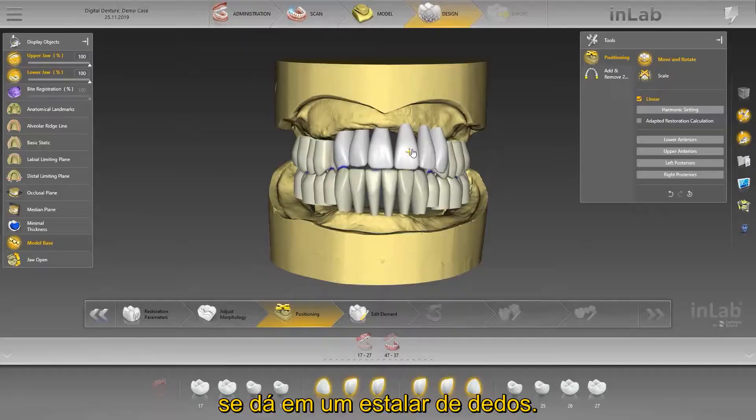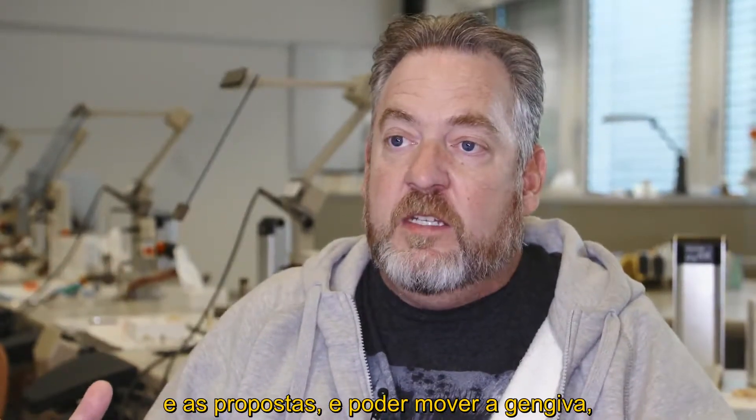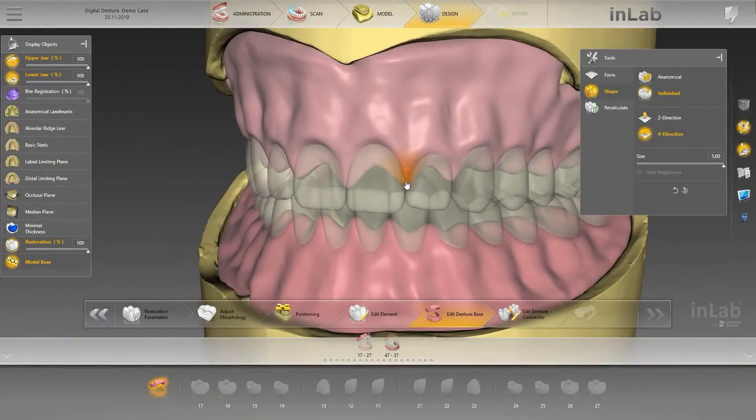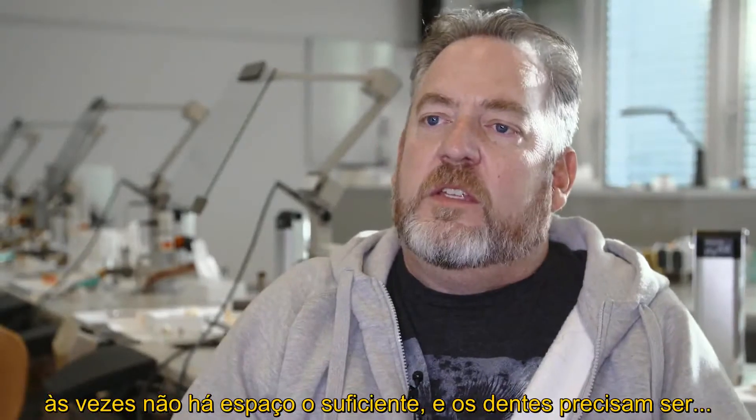The ability to move the teeth, to place them exactly where you want them — it proposes the position and then with the gingiva you can move it around and smooth it. The design software is pretty smooth when you're working with the individual teeth.